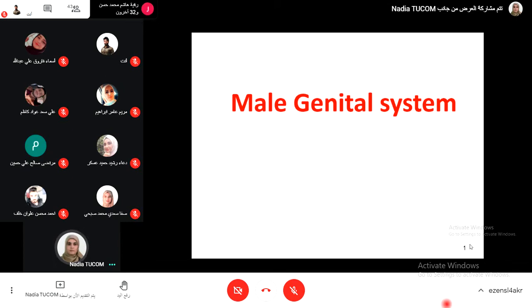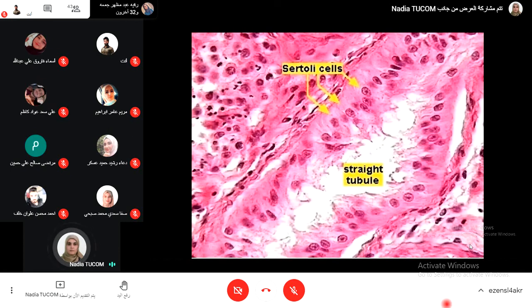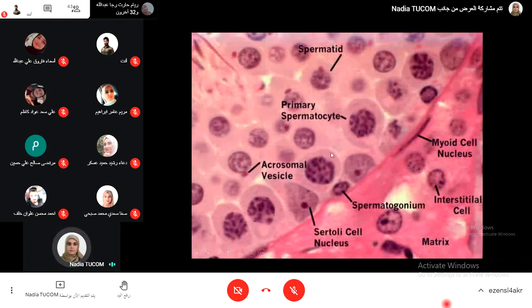I will discuss with you today the male reproductive system or male genital system. Histologically, the testis is made of Sertoli cells that are supportive cells and seminiferous tubules containing germ cells. These are the germ cells.